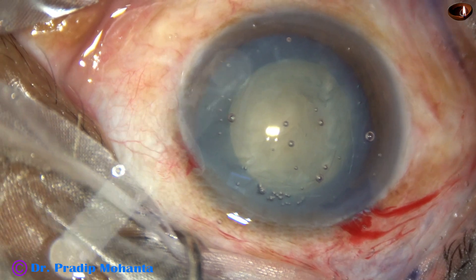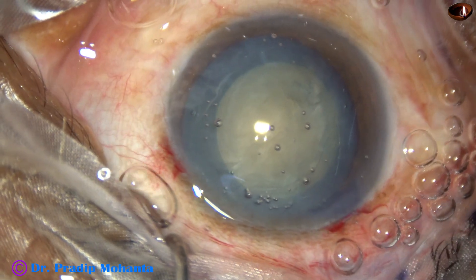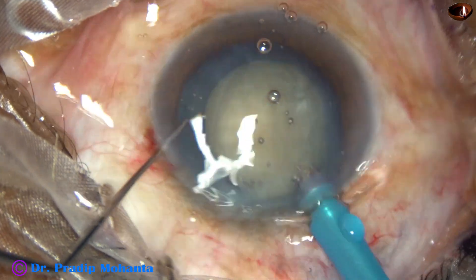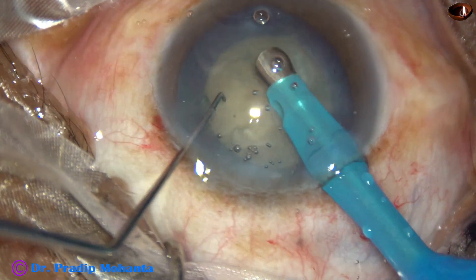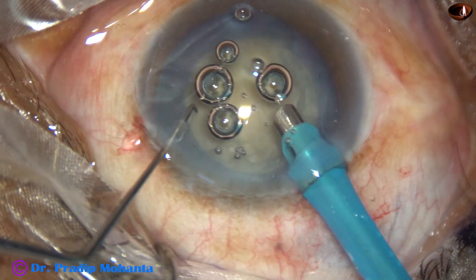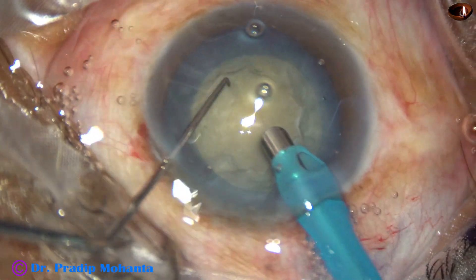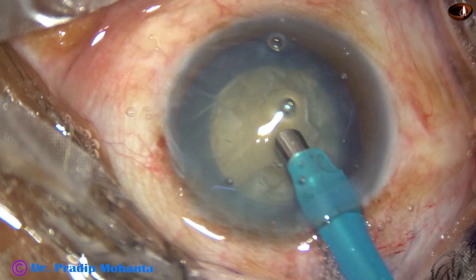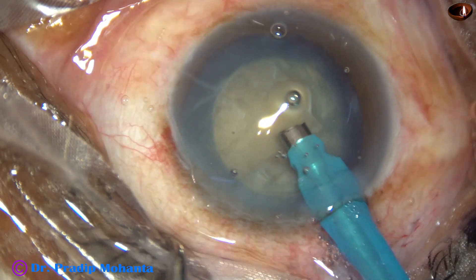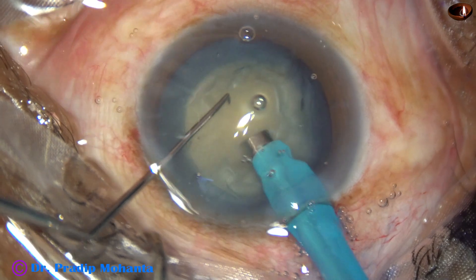The sculpting is done with low vacuum and the ultrasonic energy is according to the hardness of the nucleus. In this case, ultrasonic power was 65%, flow rate was 20, and vacuum was 60 millimeters of mercury. For sculpting, the handpiece is turned to make the bevel up, and here goes the sculpting. The ultrasonic energy is applied while going forward.